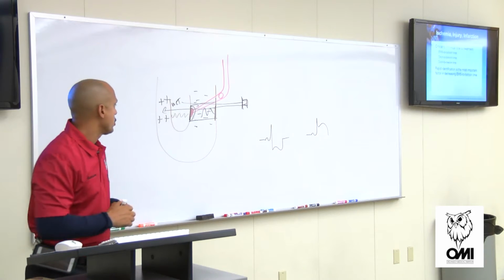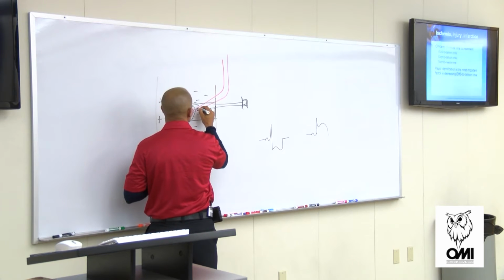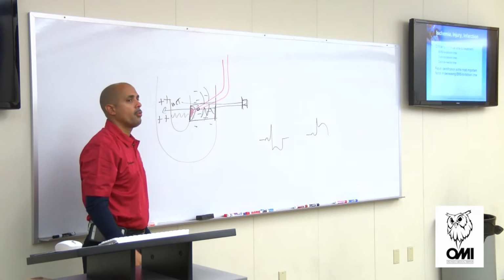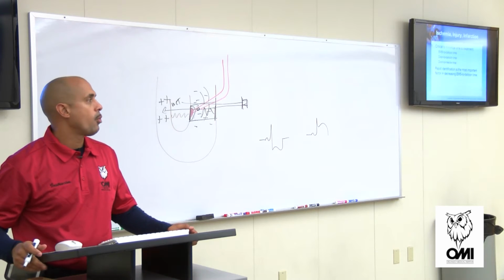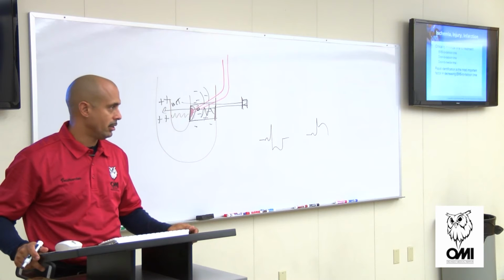Elevation. So if I take this same artery that I drew here and say, you know what, the blockage was over here, will this tissue right here still perfuse? Yeah. So will my MI ever be transmural? So what one thing I won't see? ST elevation, because it has to be transmural.